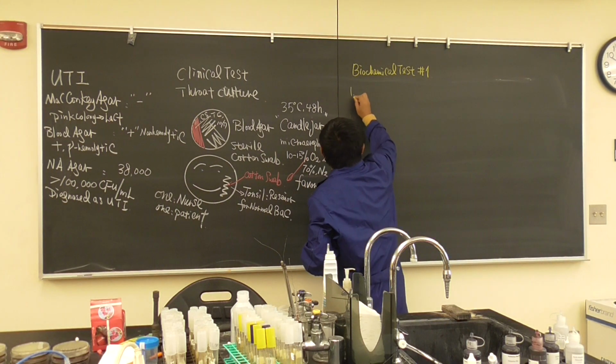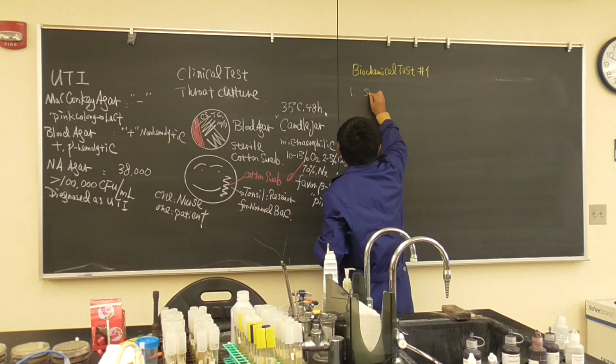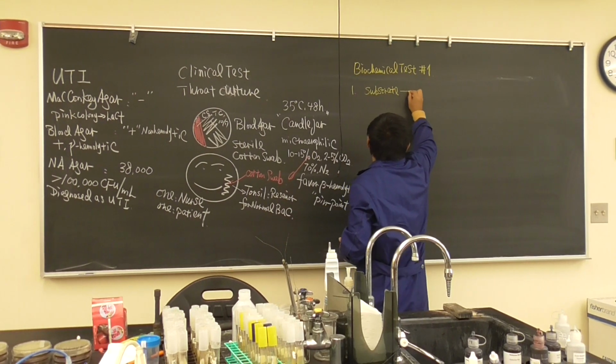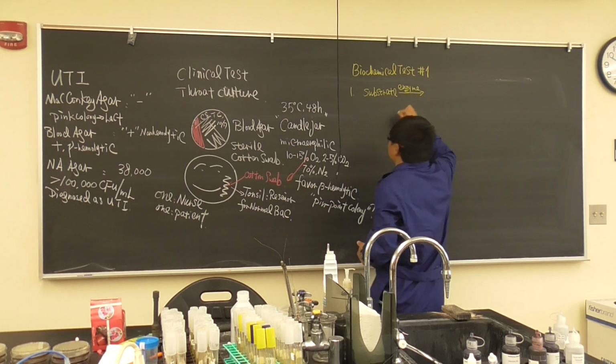So first of all, an overview of why we can do biochemistry testing. Because there is a substrate, and the bacteria has an enzyme. The enzyme can break it down.